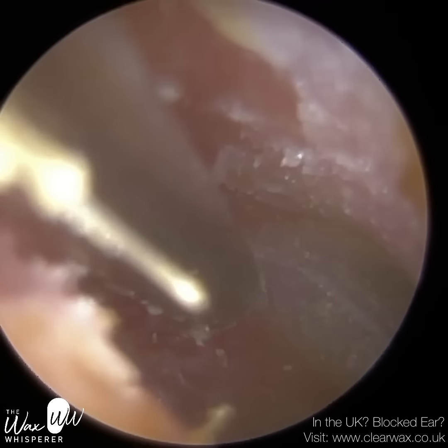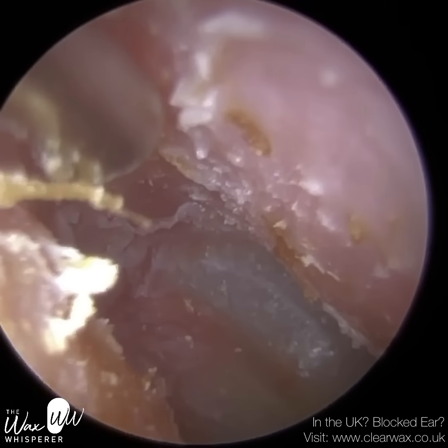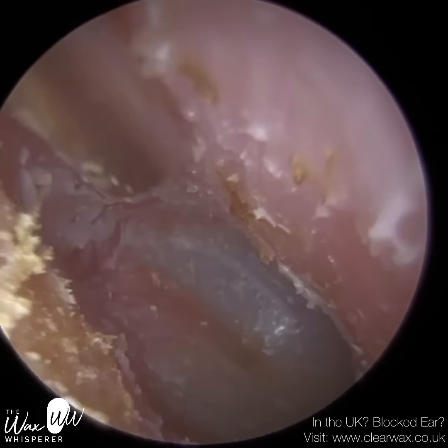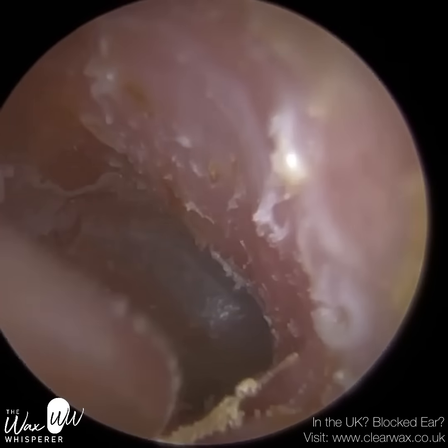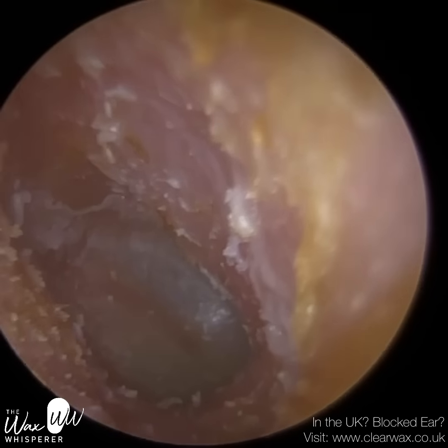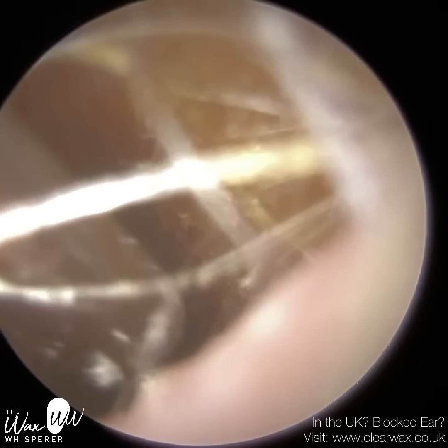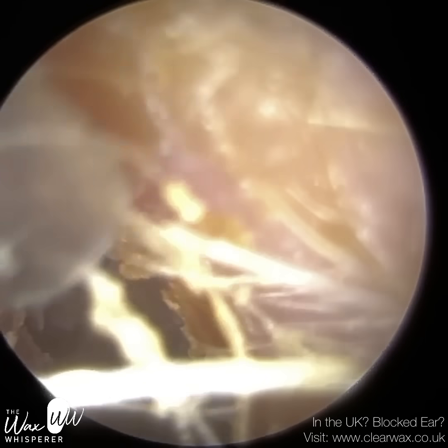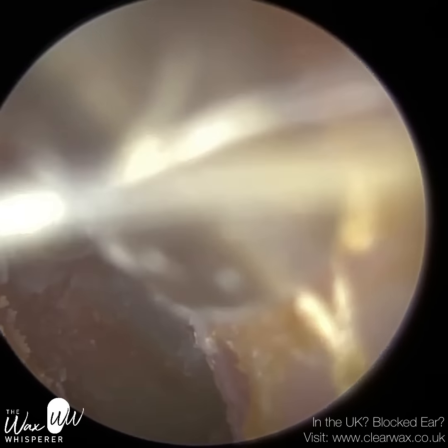We're just going to be really careful because we're really close to the eardrum. We don't want to perforate it. So I've got as much skin out as I feel I can, as comfortably as possible in that region. Just coming away on the posterior canal wall, and I'm just gliding over this. That was more on the cartilaginous portion, so we can put a bit of pressure there. It's not going to be uncomfortable for the patient. And we're back now near the entrance, and again, just peeling away, trying to get some excess skin off.